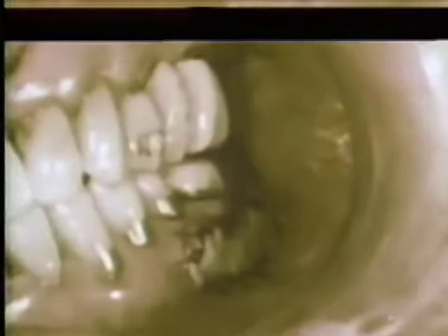After a warm saline-saturated sponge has been briefly held against the graft to minimize submucosal bleeding, a periodontal dressing is applied. This is a Baer-Sumner pack, which has been covered with a modified Kirkland pack. Both the pack and the donor site are covered with surgical adhesive foil.